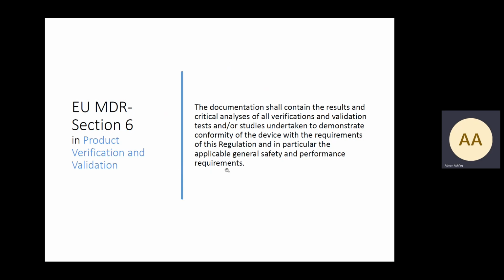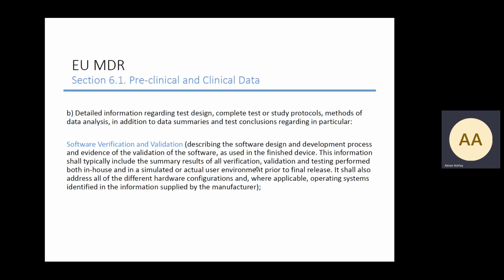Section 6 of the MDR, product verification and validation, describes documentation which shall contain results and critical analysis of all V&V tests, verification validation tests, undertaken to demonstrate conformity of the device with the requirements of this regulation, and in particular, the general safety and performance requirements which need to be covered. And then there's also preclinical and clinical data.